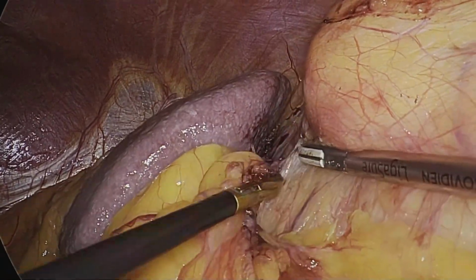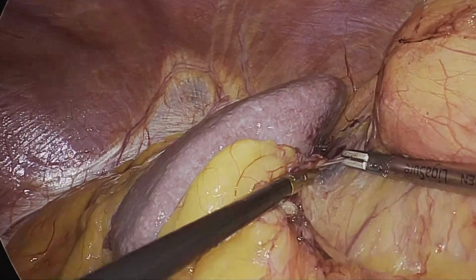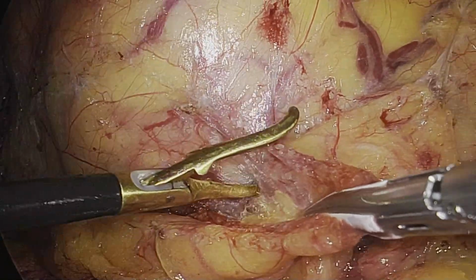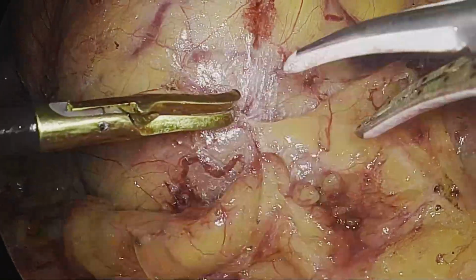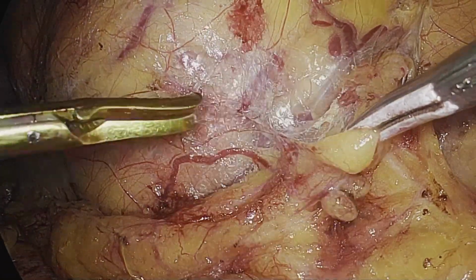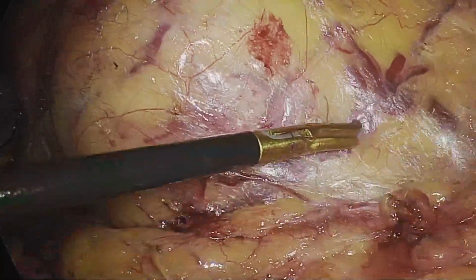There are a few indications in which the adrenal gland can be removed, like in upper pole tumors, or when the adrenal gland is infiltrated with the tumor, or a plane cannot be developed between the upper pole of the kidney and the adrenal gland. So here we are particularly planning to spare the adrenal gland.